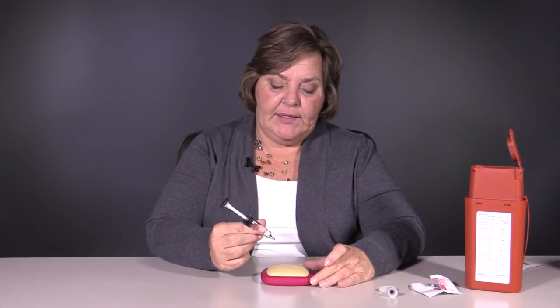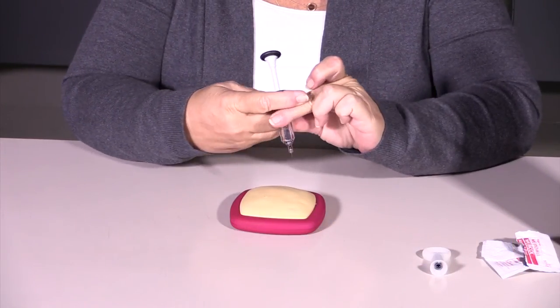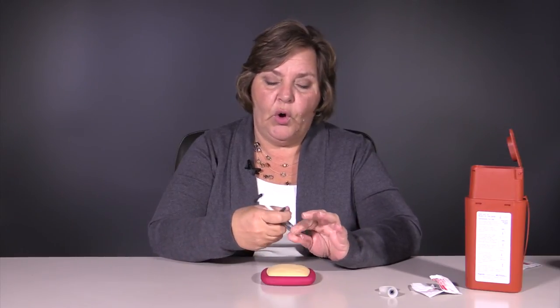You're going to hold the syringe in a way that's comfortable for you. The company has made this easy — it can be held like this, or like this. Get used to the syringe and see what is a comfortable way for you to hold it.